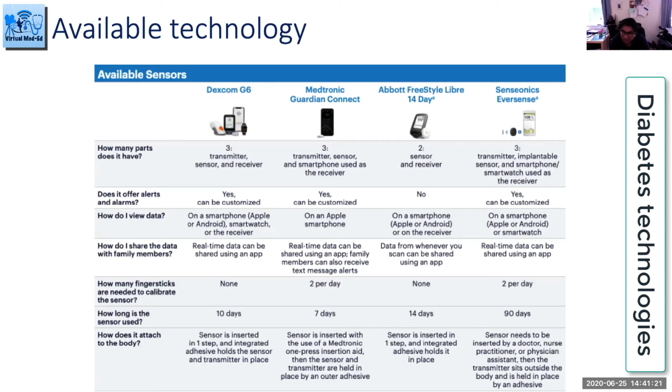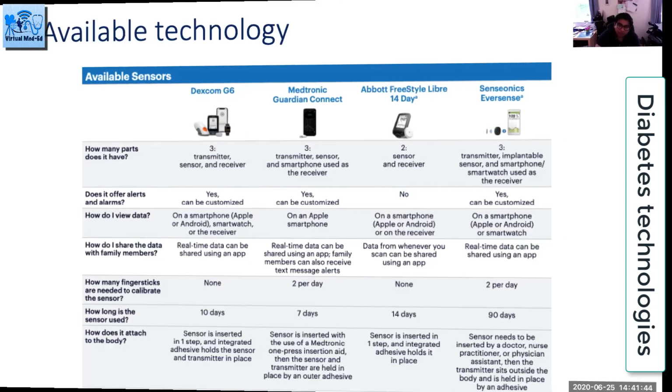We have about 8 patients in our trust, but unfortunately, Senseonics have withdrawn from the UK market because of poor uptake. So it will be available in Europe, but it's been phased out of the UK. I've got a few patients I need to take off once the sensor duration has expired, and the sensor can last up to 90 days. And there's more to come.